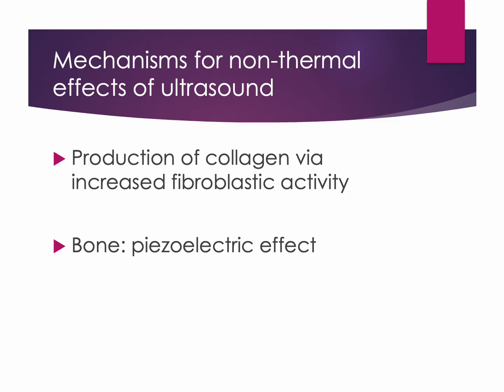Bone is a piezoelectric material, meaning mechanical deformation can generate small electrical potentials within the tissue. Normally, when bone experiences mechanical stress during weight bearing or movement, these electrical signals help regulate bone remodeling by influencing osteoblastic and osteoclastic activity. Ultrasound creates mechanical pressure waves that may mimic some of these mechanical stresses, potentially generating localized electrical changes within bone tissue.